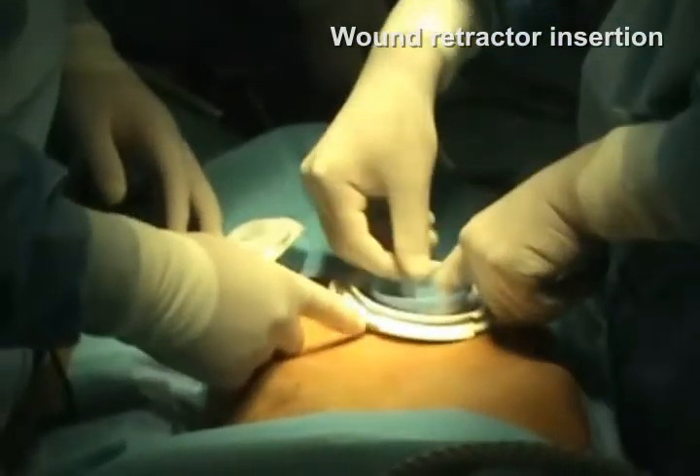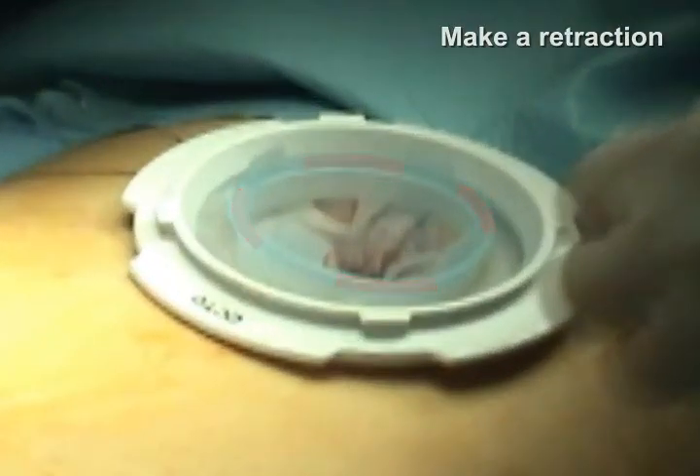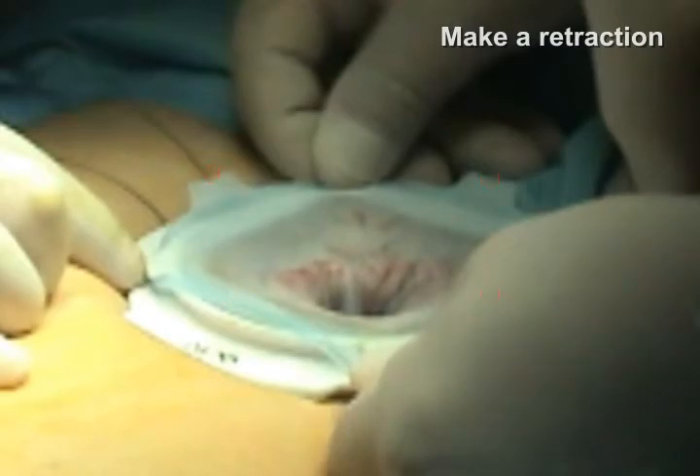Make a retraction by pulling out the silicone into four sides and anchoring them to the four connection points. It will be much easier to make a retraction with an assistant.